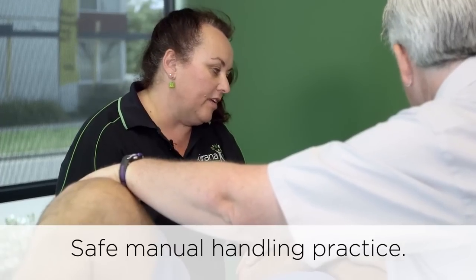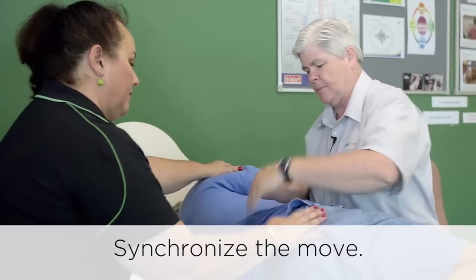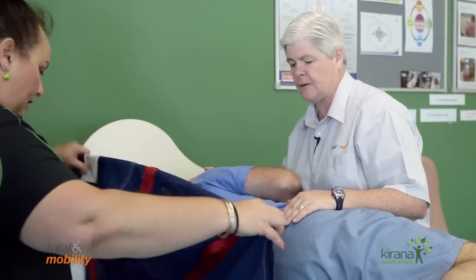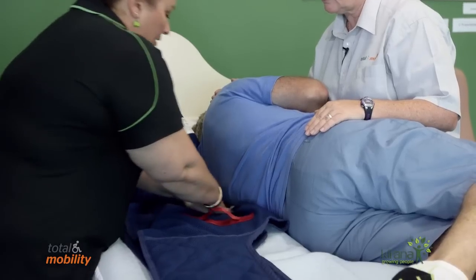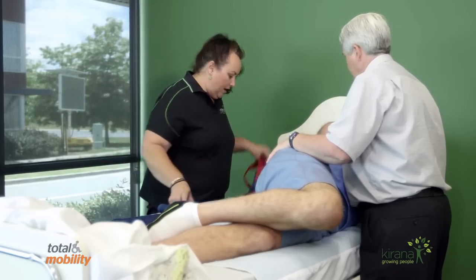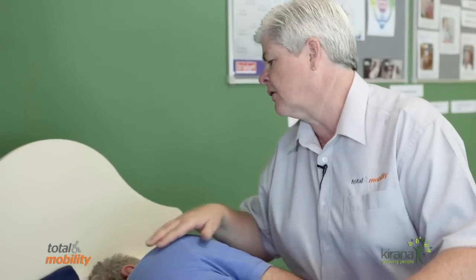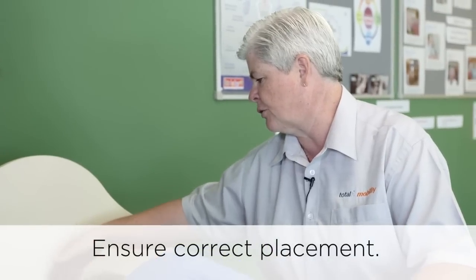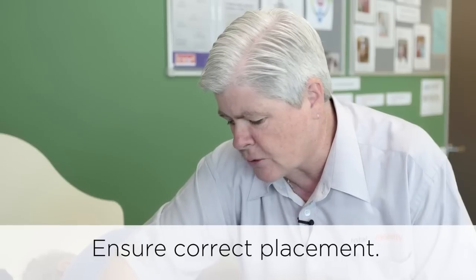I'm going to place a hand on your knee and on your elbow and roll you to me. At the count of three we're going to roll you over towards Angela — one, two, three, roll. I'm going to hold you in position here while Melissa places the sling in the right position. I'm now placing the sling in the correct position behind your back, using my hands to slide the sling in. I'll fold over the top part of the sling only, to protect you from any hooks or clasps.